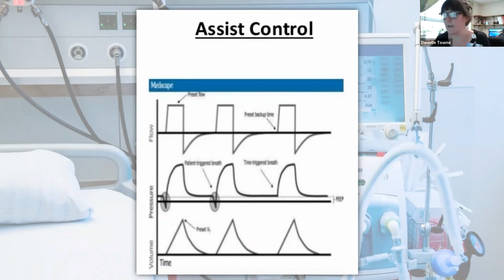In the example on the screen here, you can see that every breath is the same sized waveform, indicating the ventilator is controlling every breath. Now, the first two breaths you can see here are initiated by the patient. We know that because we see this little downward spike here. So that's a patient-initiated breath versus here, you don't see that. That's a non-patient initiated breath. That's a ventilator breath.